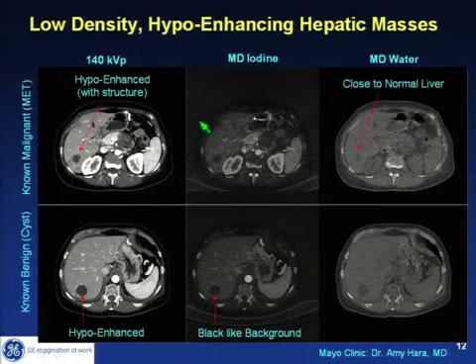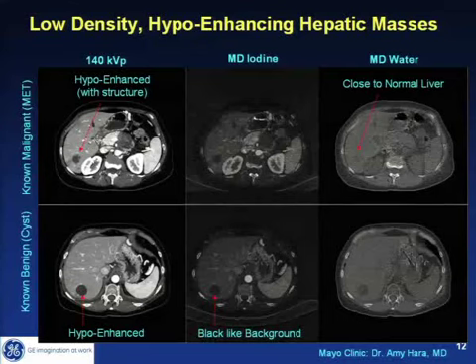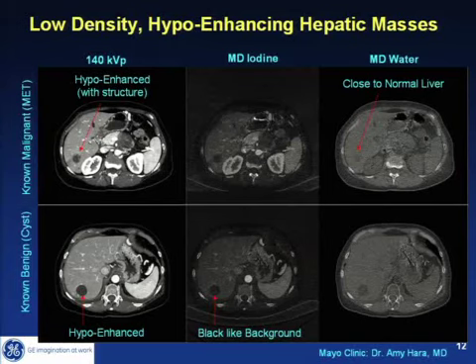As illustrated in this picture, this is a patient where there are two different lesions, and both lesions show hypo-enhancement. That means there is some iodine contrast uptake activity. So, which one is malignant, which one is benign? CT typically cannot answer that.